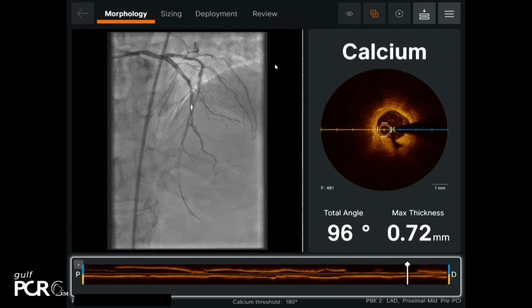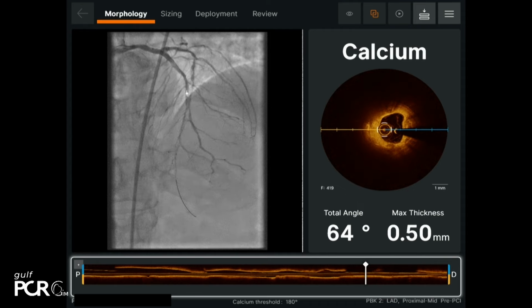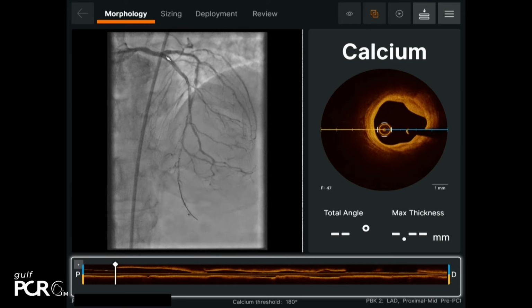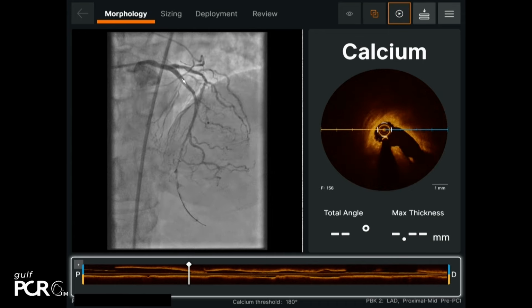Yes, you can go and explain what you found. See, now we're coming to the area that we have ablated and ballooned. So this is the site where we're planning to start our stenting. I'm going from proximal to distal, so I'm going back again. And this is the site of the nodule. Quite eccentric.